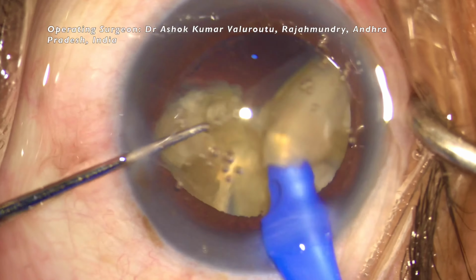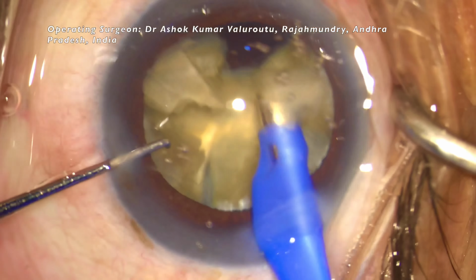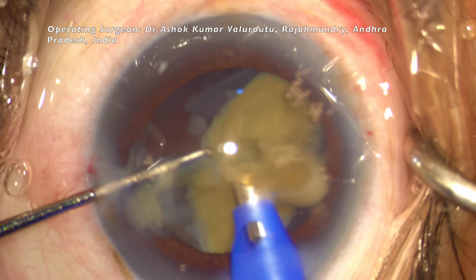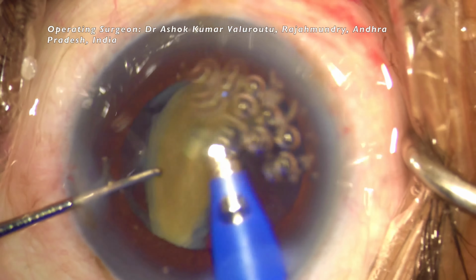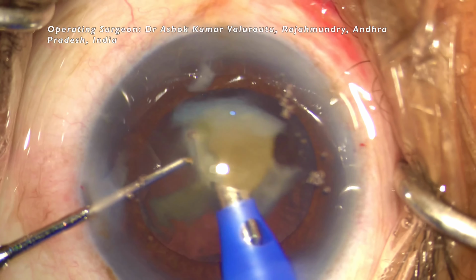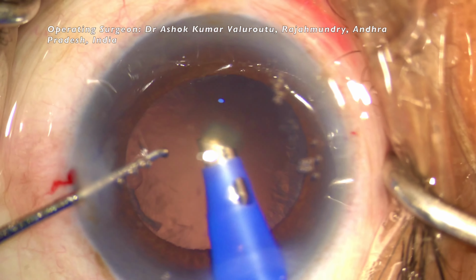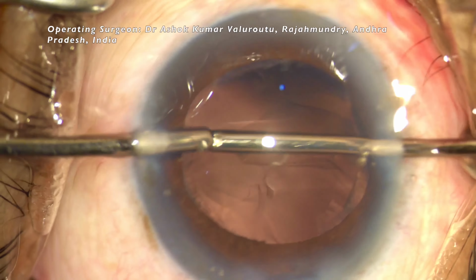Now moving to ultrasound 2 or quadrant mode, each and every quadrant is properly emulsified and aspirated with pulse energy in ultrasound 2. You could see the posterior plate is intact, but the nucleus material is easily emulsified. It is due to the use of higher energy.